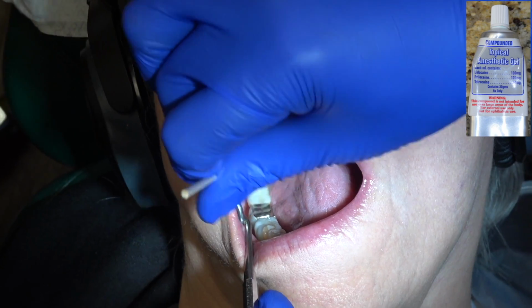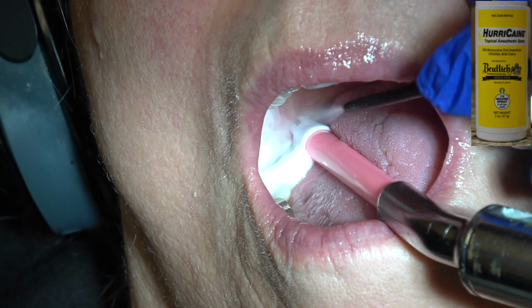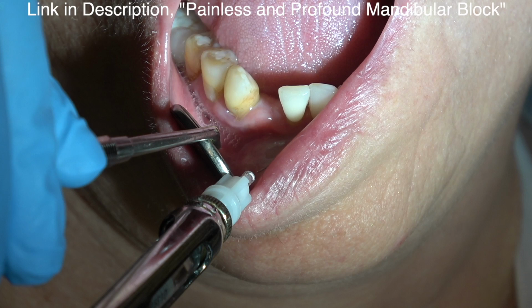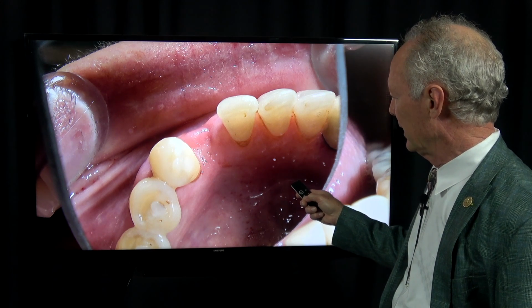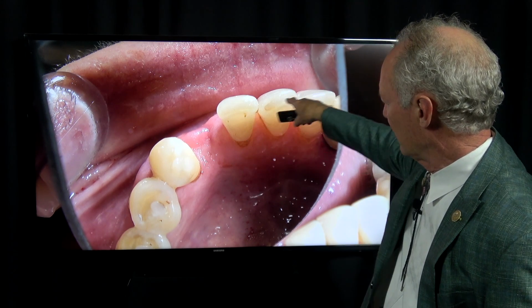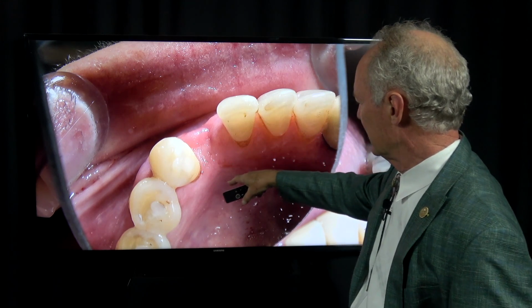So in this case, we're going to use a longer small diameter implant, which again, small diameter means it's less than 3 millimeters in diameter. So I'm going to anesthetize the tissue. The key with a small diameter implant is that you start it in the right direction. So you really want to pay attention to the angulation of the adjacent teeth.